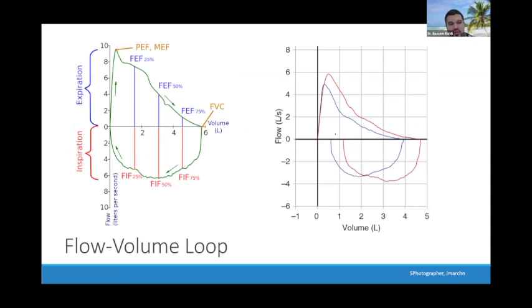The next one is the flow volume loops. Dr. Noor also explained this nicely. It's the first thing that we usually look at to assess the quality, but also to give us a hint about disease state. So as we know, volume on the x-axis, and then flow in liters per second on the y-axis. Expiration on top, and then inspiration on the bottom. Okay, the end volume, this is the FVC. So that's the forced vital capacity, okay? So that's on the x-axis.